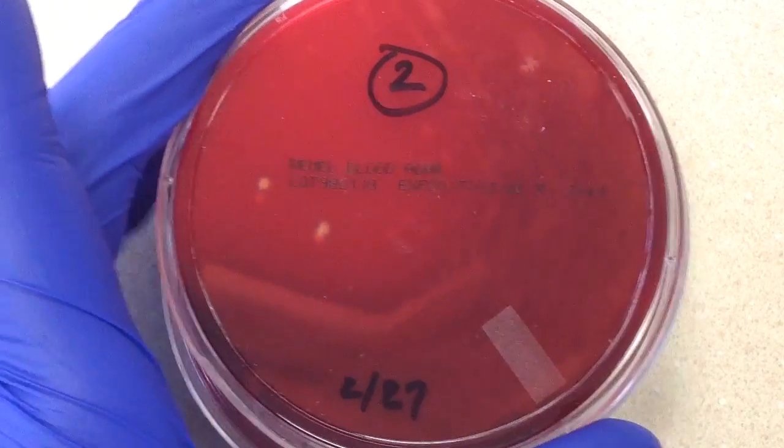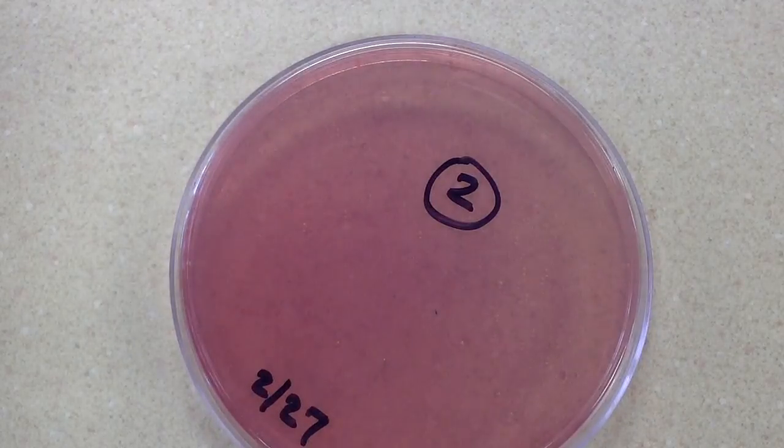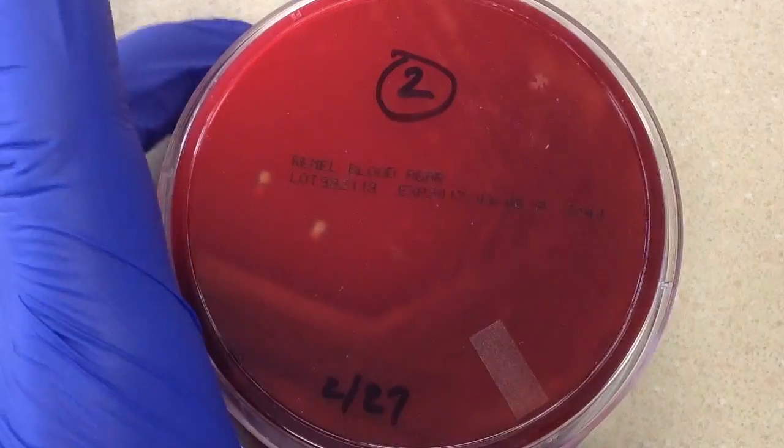On this particular culture, we have a 5% sheep blood plate, we have a chocolate plate, and we have a McConkey's. We do not have a CNA present on this particular culture.